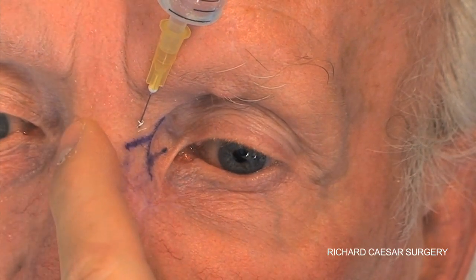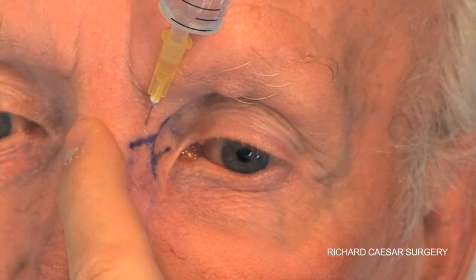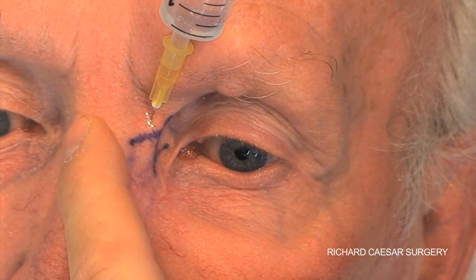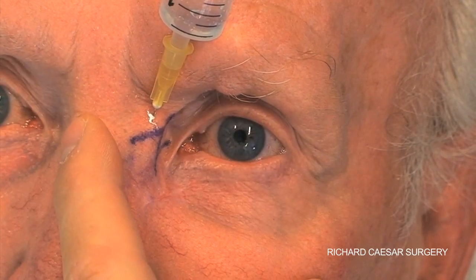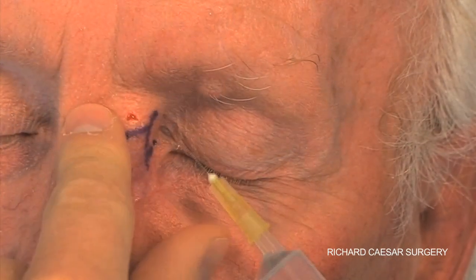Whenever you inject local anaesthetic, your aim is to minimise the infiltration pain and to minimise bruising. To this end I always recommend using a 30-gauge needle and injecting very, very slowly.